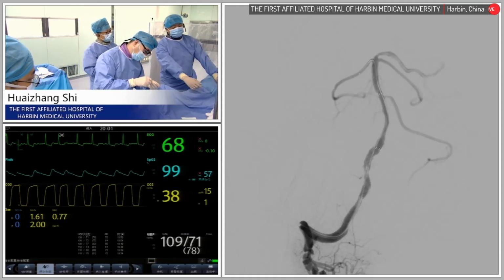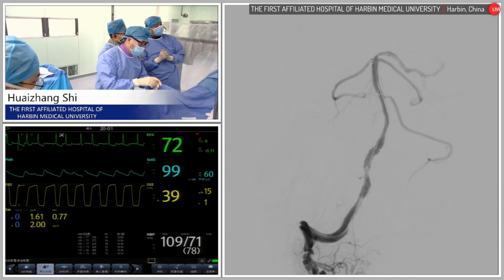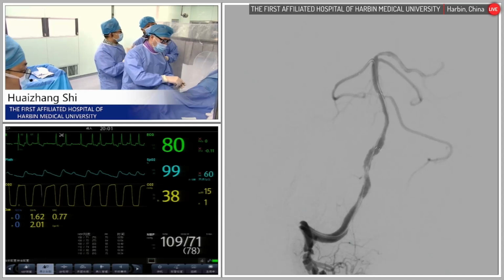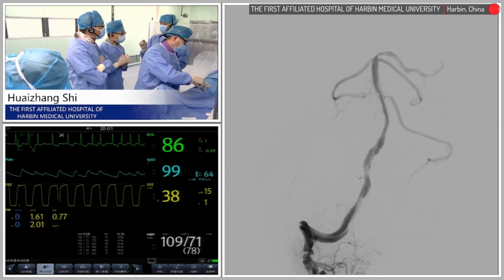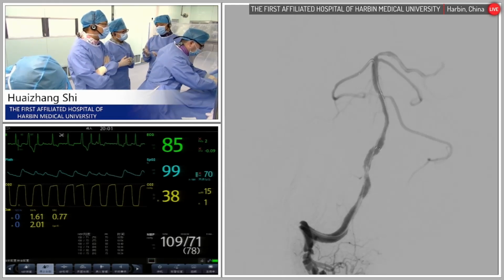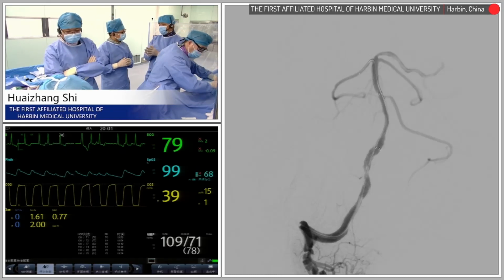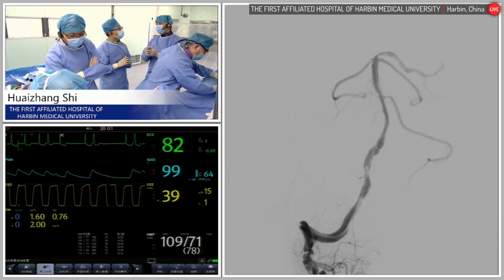Dr. Shi, right now we are kind of worried there may be a dissection, that's why we decided to stent here. If there is no possibility of dissection, we just leave it, right? Only balloon dilatation, if the lesion is very short. If after the balloon inflating there is no dissection and the stenosis is not very high, I think I will leave it alone.